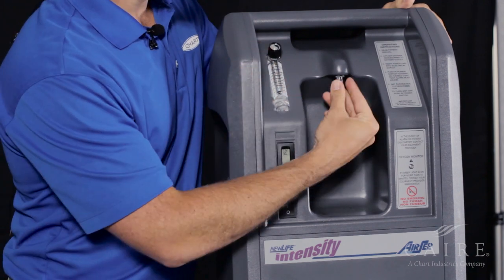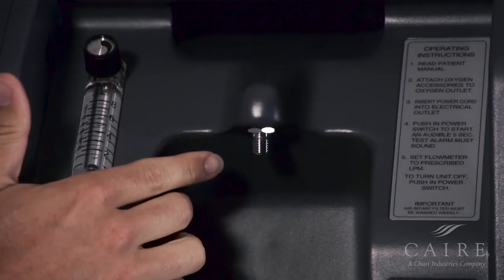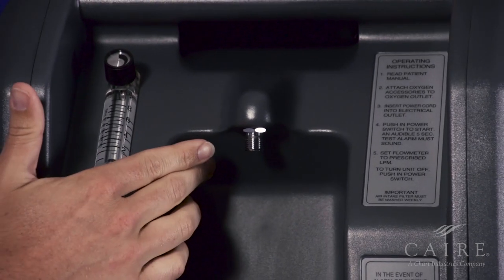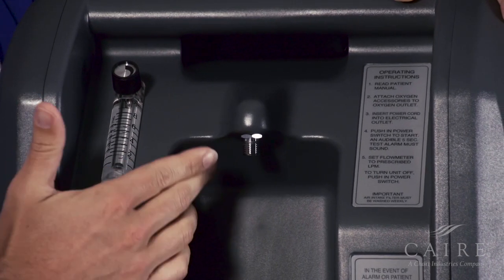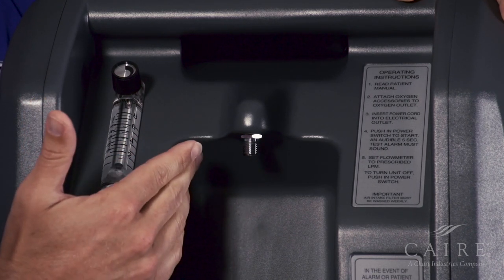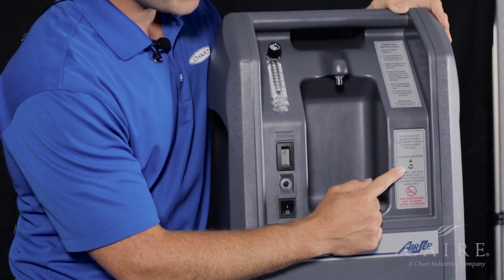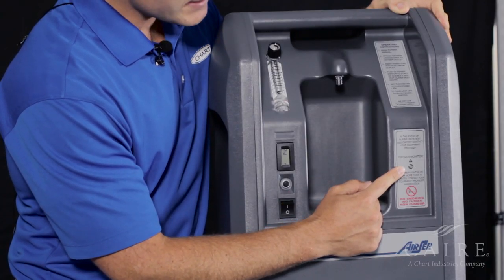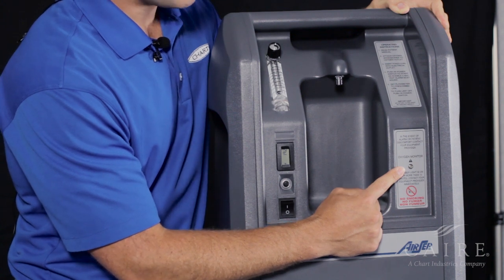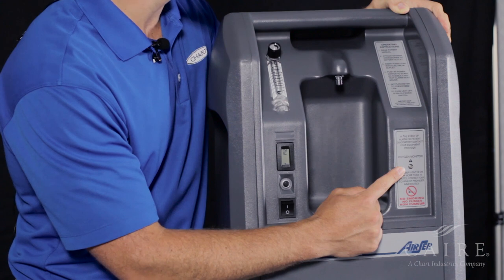Right here in the middle is actually where your air output is going to be. If you notice right now, it just looks like threads. Depending upon whether you're going to use a humidifier bottle or straight cannula determines the setup, which we'll get into. Over here on the far right is your oxygen monitoring, which is constantly monitoring the concentration that your unit is producing.